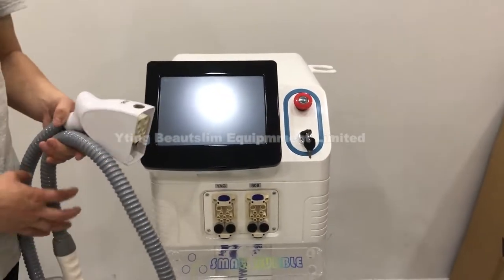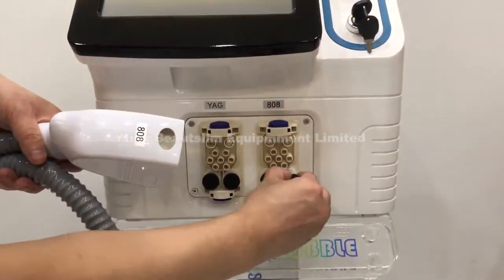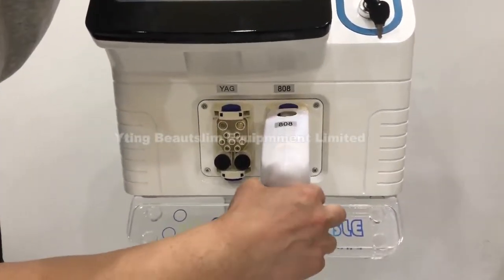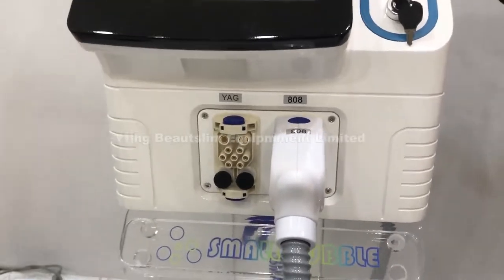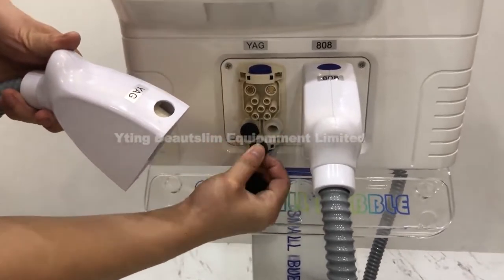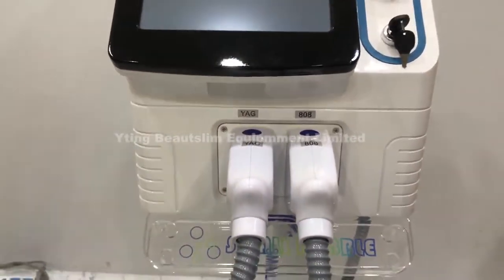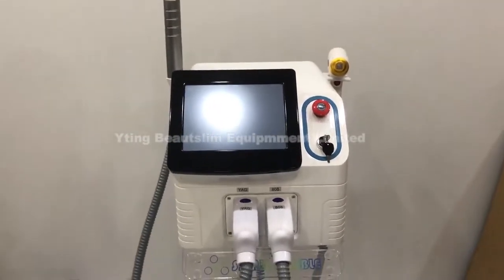Now we insert the handle. This is the 808 — remove these black stickers and insert the handle. Then insert the petal.